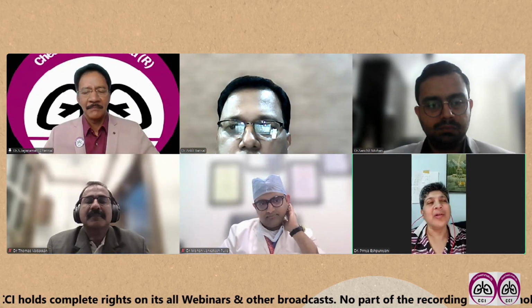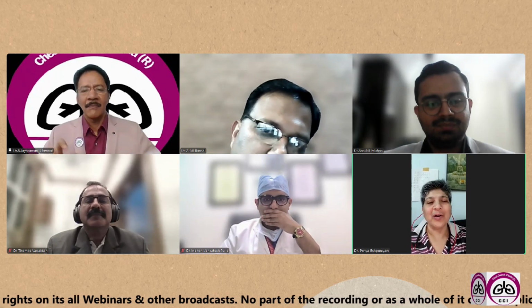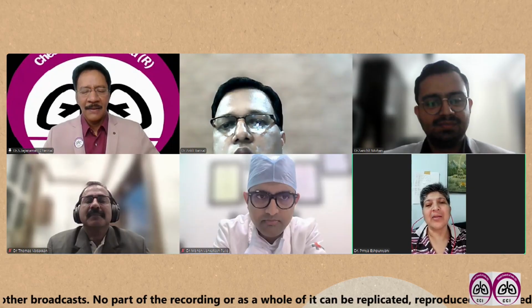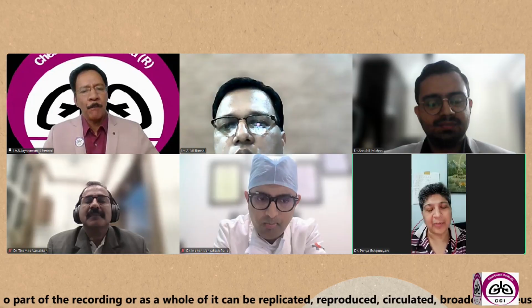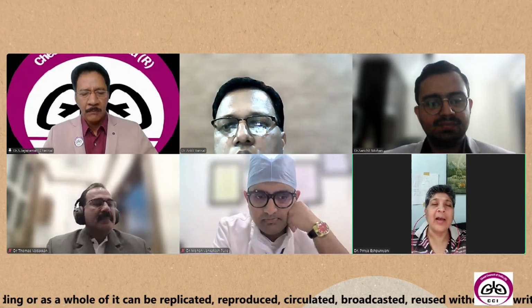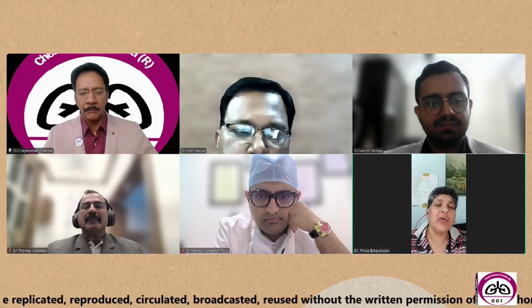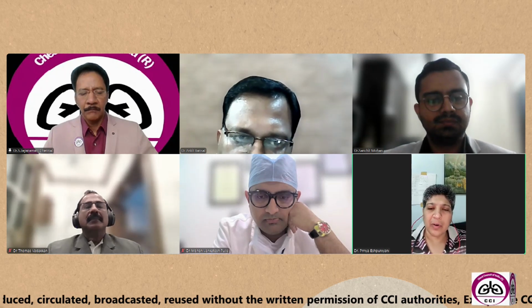I have excellent pulmonology colleagues where I work, so I almost never have to resort to surgical techniques to confirm my diagnosis. There are a few additions actually. A randomized control trial has already come out in 2023, a non-inferiority trial, which has proven that even if a patient has a negative EBUS, we do not have to do a mediastinoscopy. So it has already come as a randomized control trial.